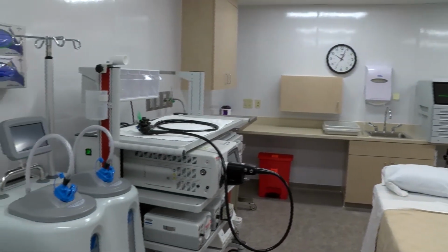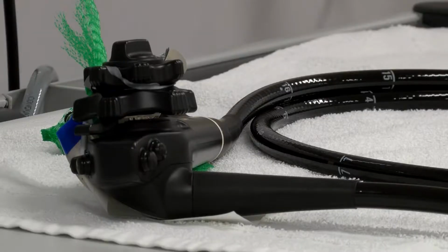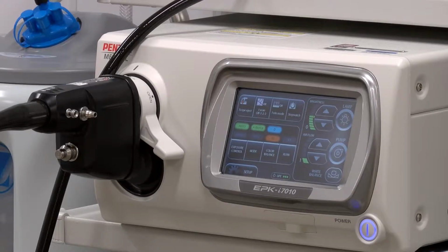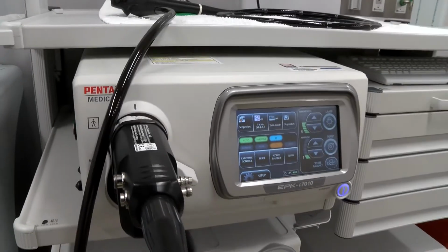You know, the technology is improving, the visualization is improving, the screens, the monitors all have better high resolution to find smaller and smaller polyps. And so when we're looking in the colon for polyps, which are precancerous lesions, we're looking for things anywhere from about 1 millimeter in size up to over a centimeter. So we're able to magnify the lining of the colon and find these. So the earlier we find the cancer, or if we find polyps and remove them, the better the patients do.